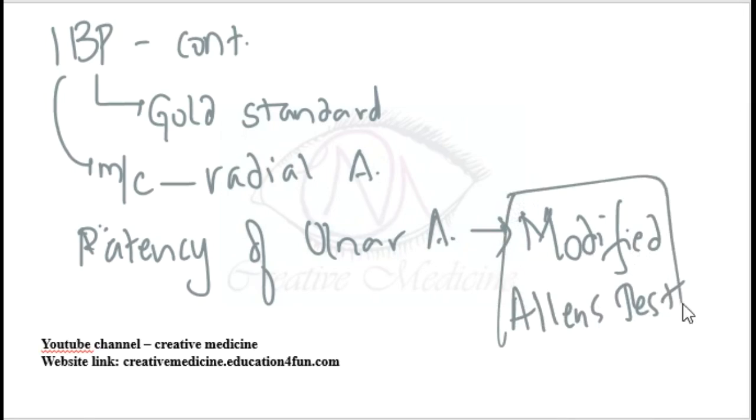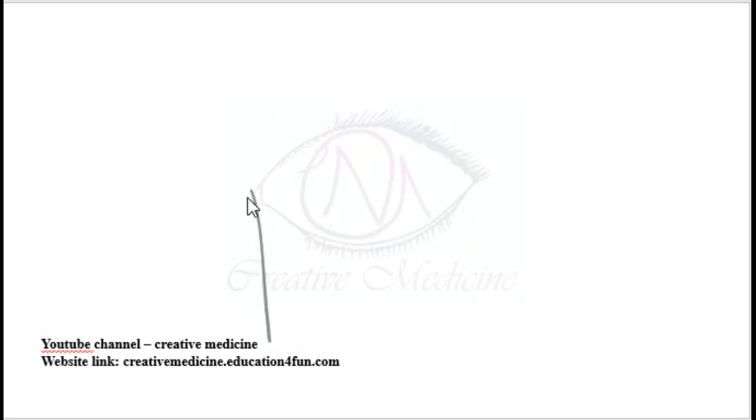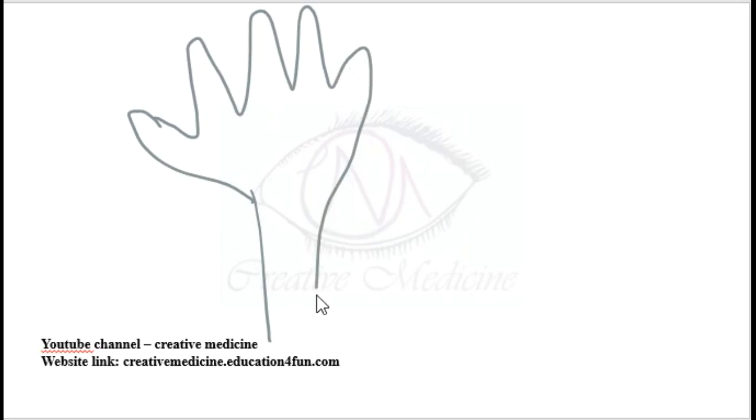When you occlude the ulnar artery with your fingers, first you will have to occlude both the radial and ulnar arteries with both your hands.